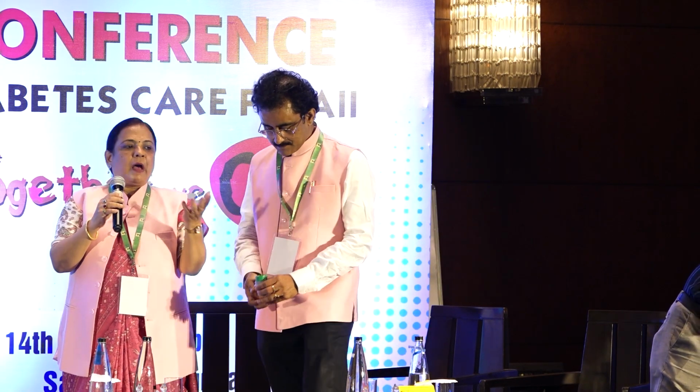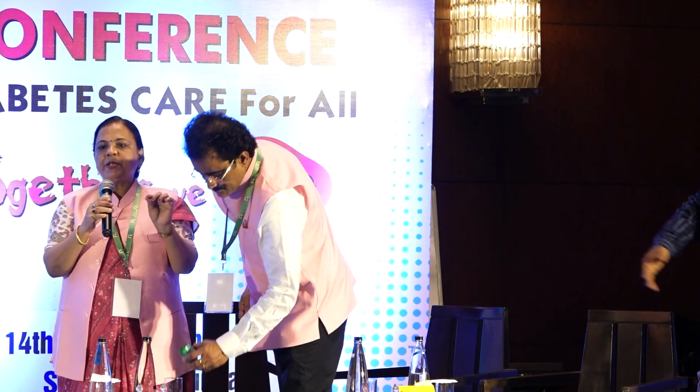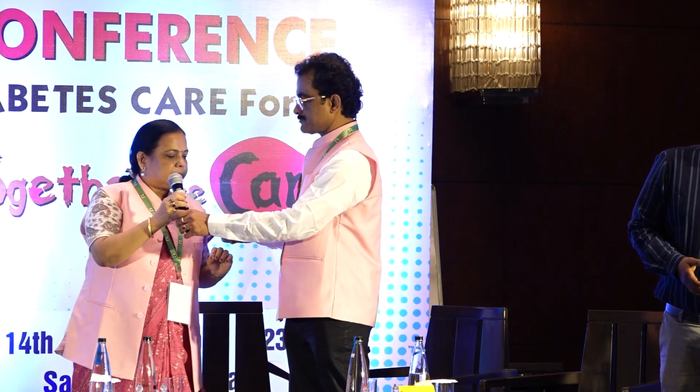See, the indications Arindam will tell. If you have a patient on multiple doses of insulin, the best possible way of monitoring is a CGM device. So without wasting time, I'll apply it on sir.